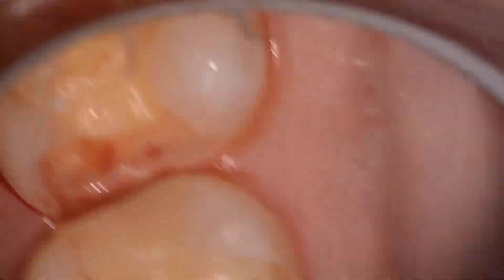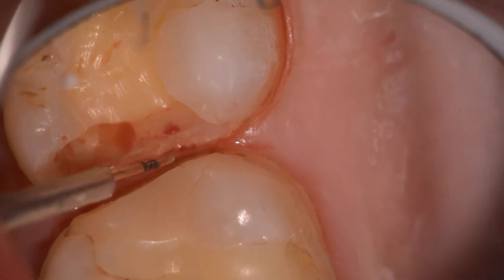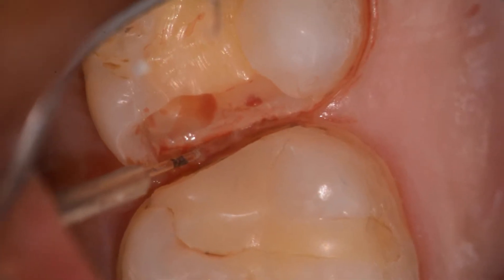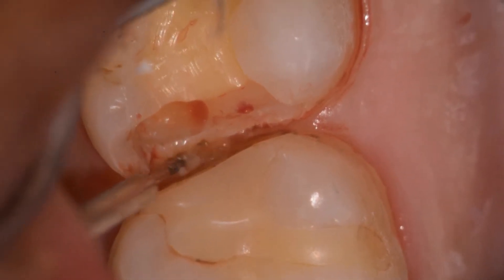We now take the tip of the laser in an initiated state. We want to try and control the hemostasis. Very, very light dabbing motions will help. We want to be creating very light touch with an initiated tip at around 0.8 to 1 watts.